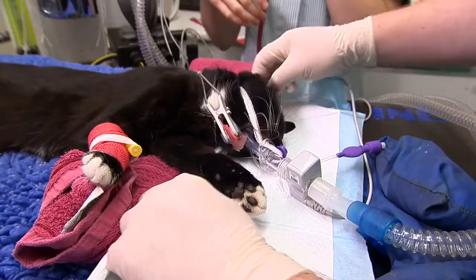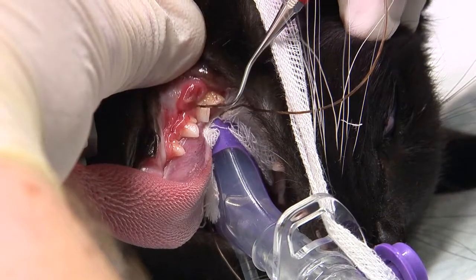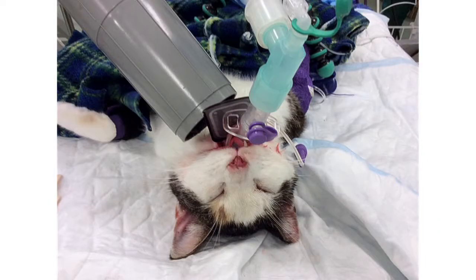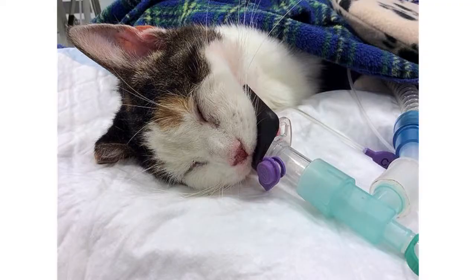It is simple to work around the V-gel for descaling, surgical and non-surgical extractions, and polishing procedures. V-gels can also be used with intraoral plates during dental radiography and in many cases will help to keep the x-ray plate stable.